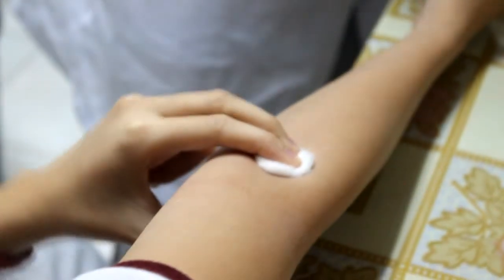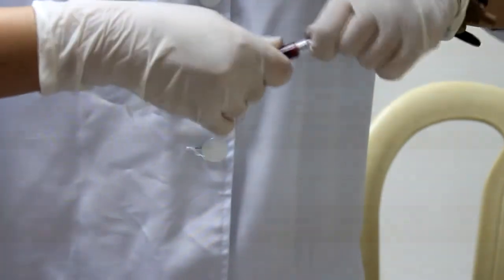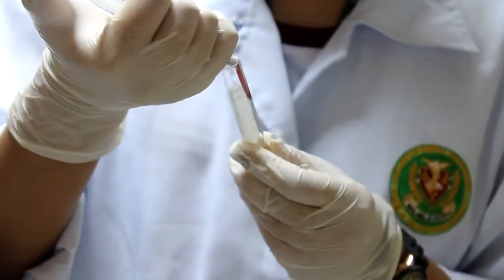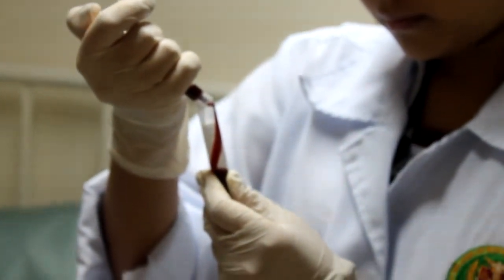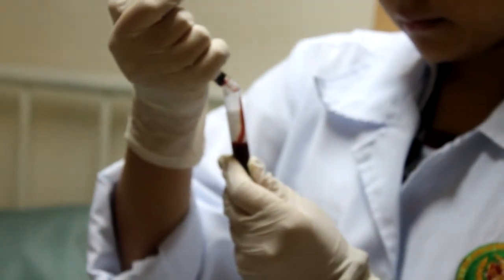When bleeding stops, apply a fresh bandage, gauze, or tape. Dispose of the syringe and needle into an appropriate sharps container. Transfer blood drawn into the appropriate tubes as soon as possible, as a delay could cause improper coagulation. Gently invert tubes containing an additive according to its number of required inversions.